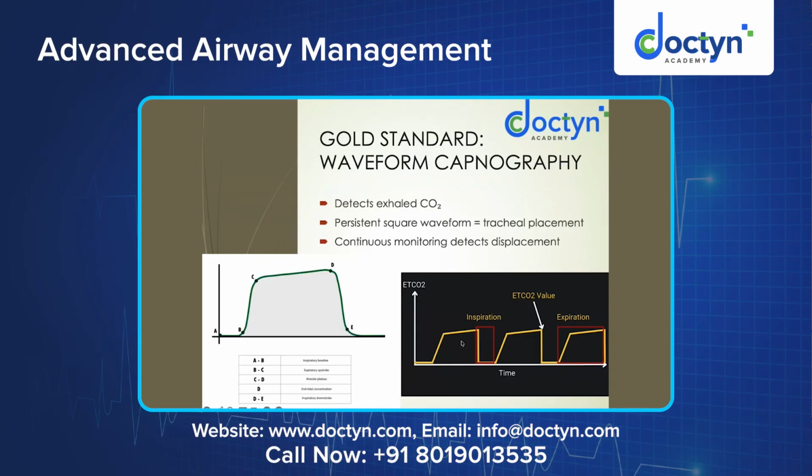So how do you label these, or how do you read these? This is a square shaped waveform which is formed on the monitor. Here the y-axis has EtCO2 and the x-axis has time. EtCO2 is the end tidal carbon dioxide, the carbon dioxide concentration in the exhaled air which is coming through the tube. Here, if you see, the carbon dioxide concentration is slowly increasing, then it plateaus and decreases. So let me know when the carbon dioxide concentration decreases.